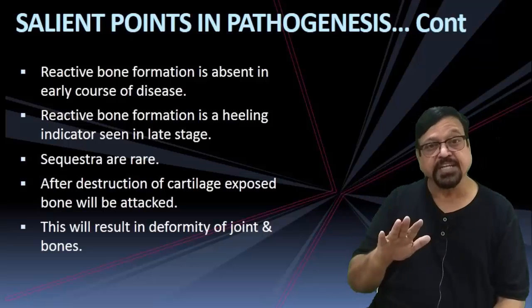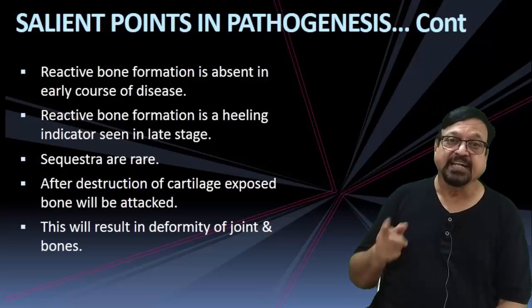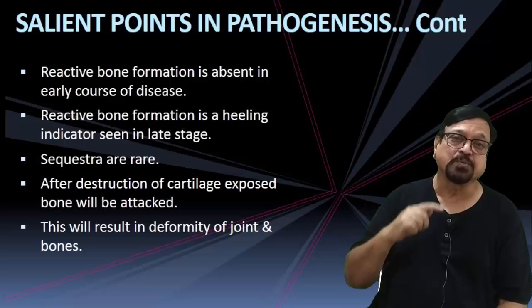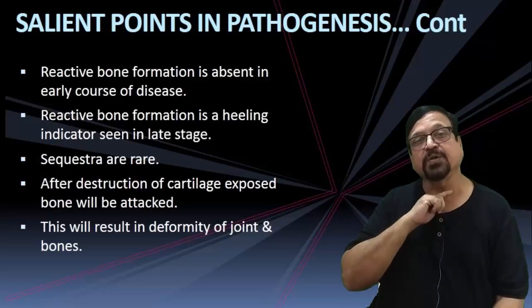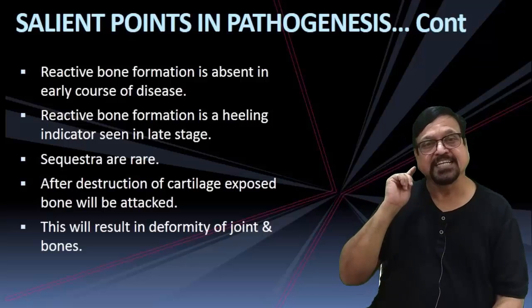Does it help in prognosis? Also yes. Because once we start anti-tubercular treatment, the reactive bone starts forming. And more reactive bone formation gives you more and more idea that the treatment is going in the right direction, the patient is getting better, and the disease is healing.